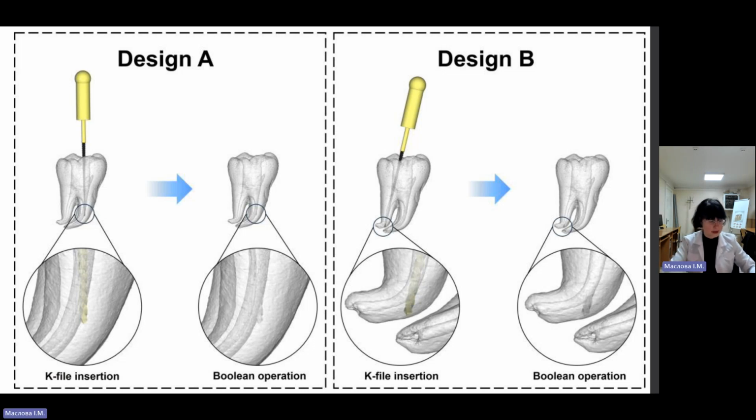Access cavity, more detailed information. The objective of the access cavity is to provide as unobstructed an access to the root canals of the tooth as possible. When mishaps occur during the instrumentation and obturation phases of the treatment, they can most frequently be attributed to an inadequately or incorrectly prepared access cavity.